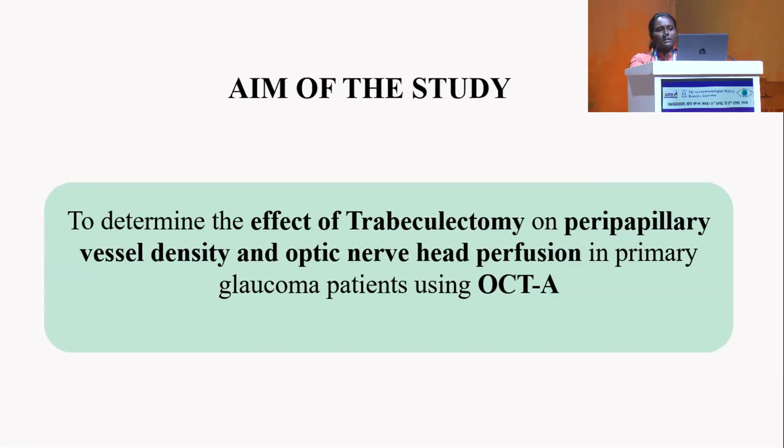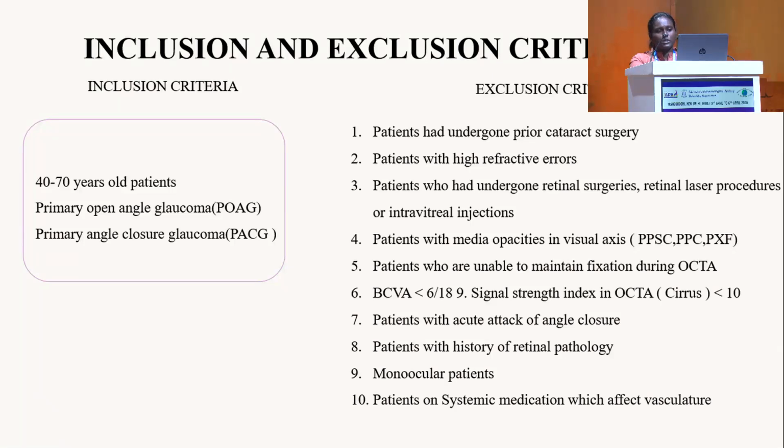So we proceeded with the aim of the study: to determine the effect of trabeculectomy on peripapillary vessel density and optic nerve head perfusion in primary glaucoma patients using OCT angiography.